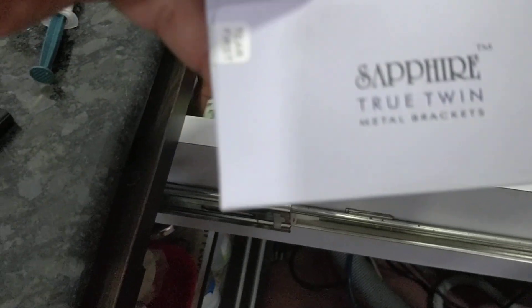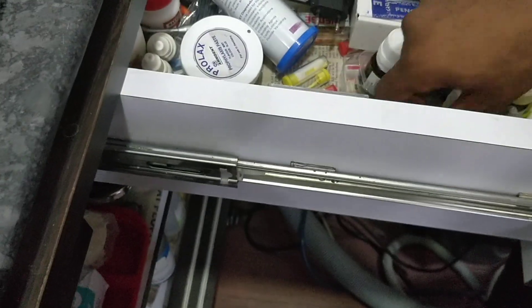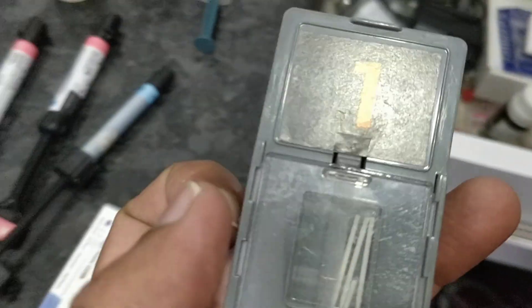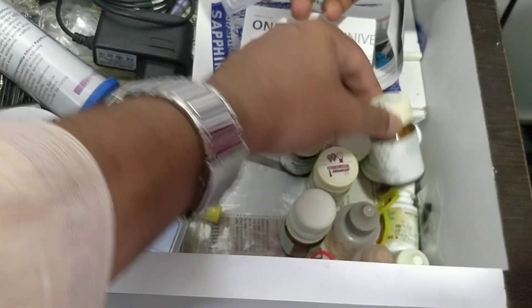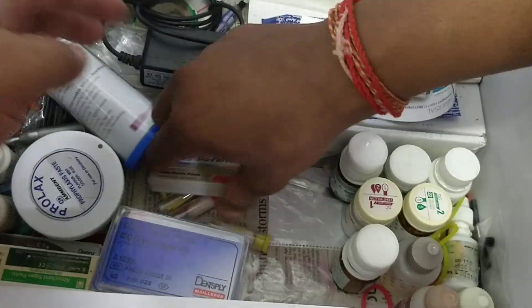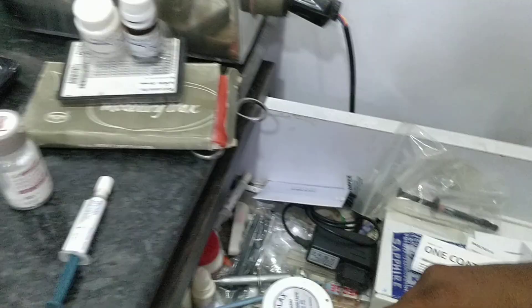This is a type 2 restorative material — you can also use a type 9. I am using Diadent paper points. This is the post I am using for post and core — this is actually Angelus post. Then a root canal sealer is also there. These are the tapes. For GP I am using Diadent and also Dentsply GPs. So there are a lot of materials which you can keep in your clinic — it's not necessary to keep each and everything.